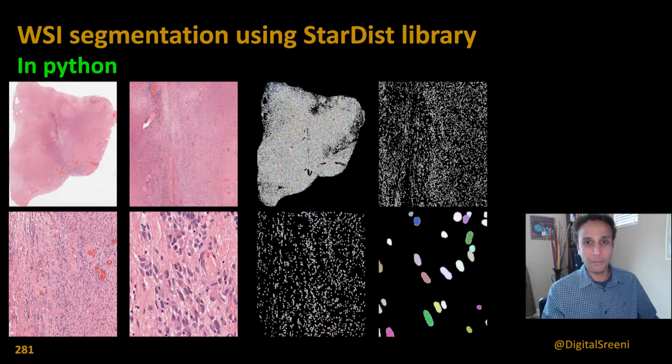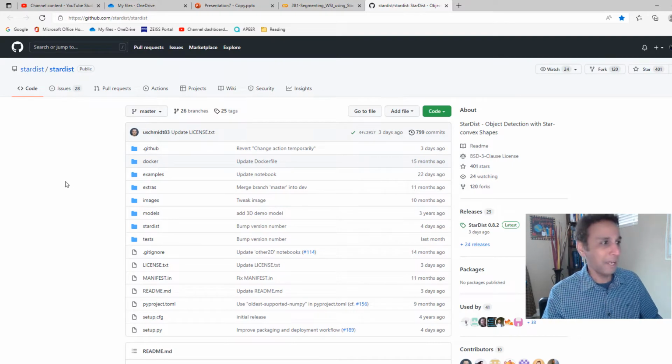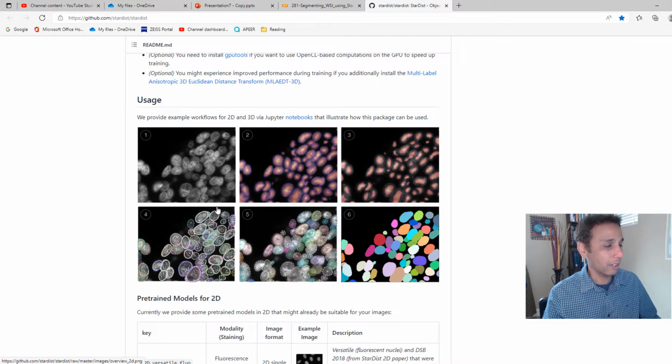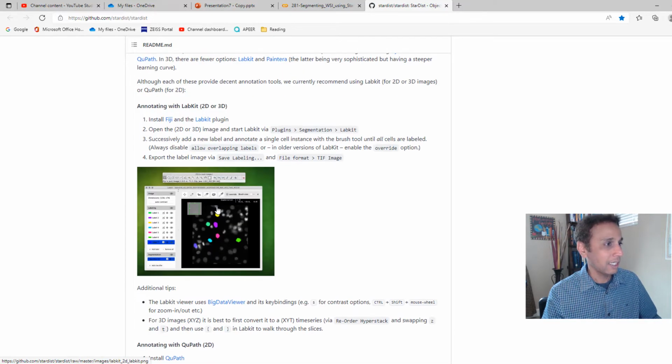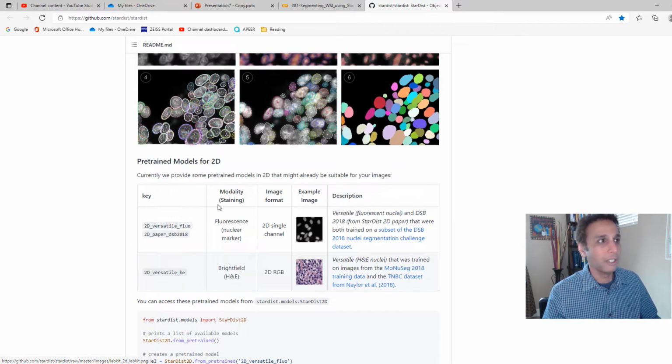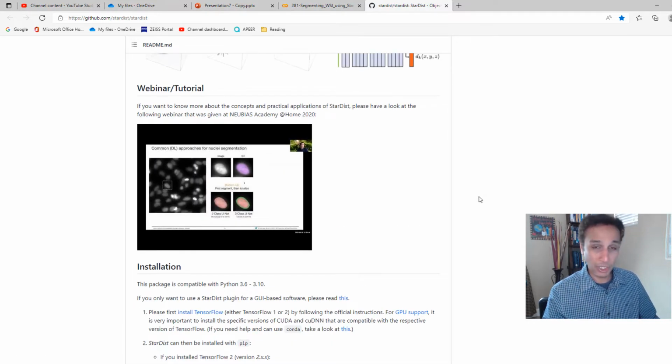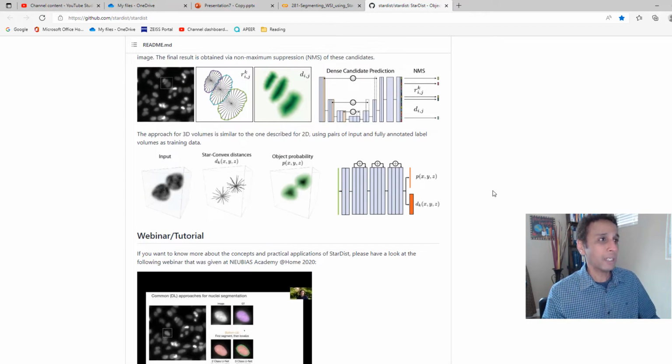And also, if you don't have that type of patience, go to their page. I'm right here, so go ahead and look at StarDist. What I'm talking about is star convex. Do they have an image right here talking about it? No, but just trust me. If your objects are rounded like these, you can easily segment them using StarDist. Okay, so with this information, let's jump in.